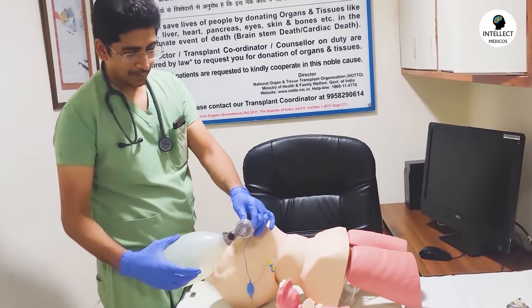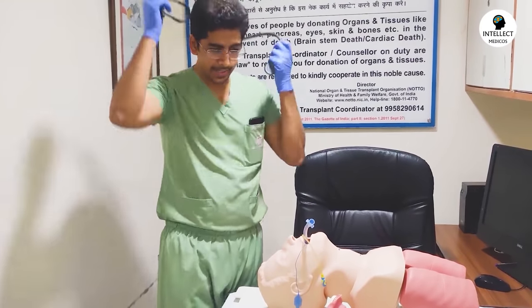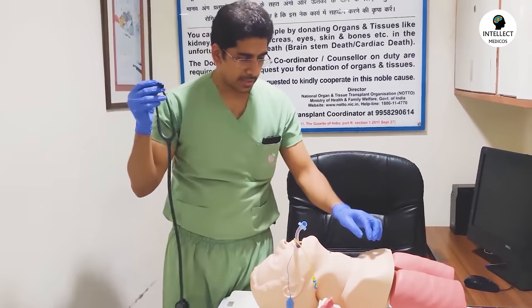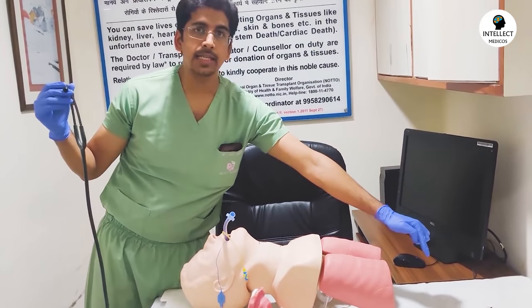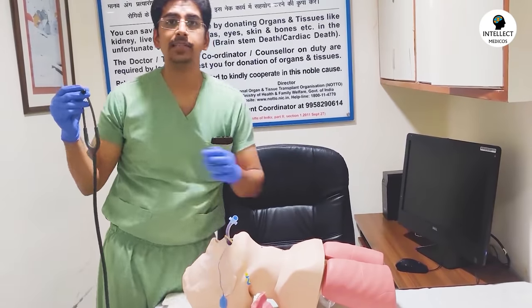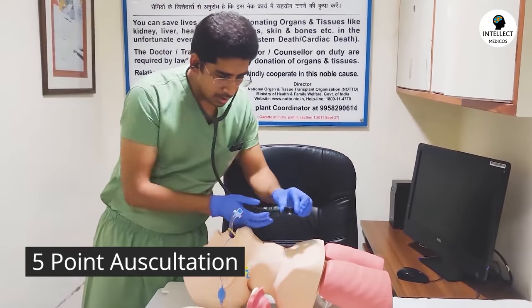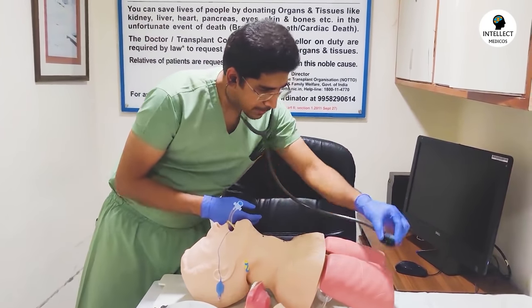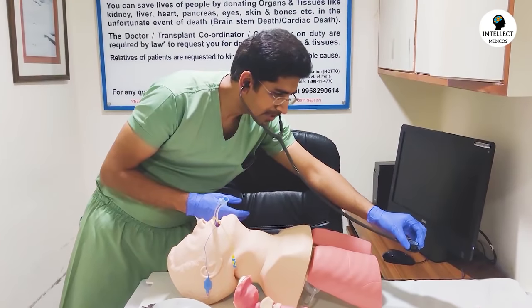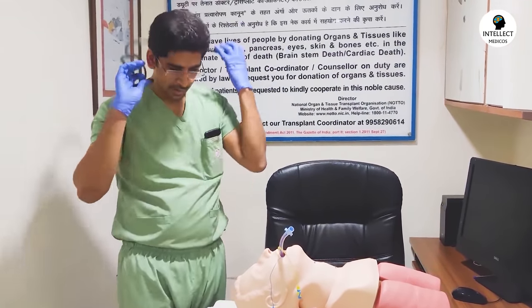After intubating, perform five-point auscultation: auscultate both lung apices, both lung bases, and the epigastrium. Air entry bilaterally over the lungs and absence of sounds over the epigastrium confirms correct tracheal placement.